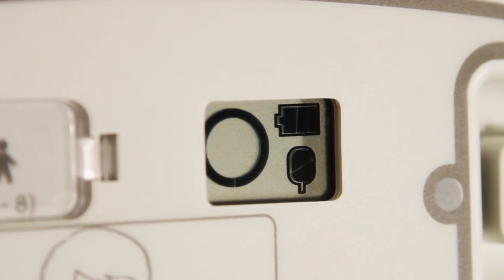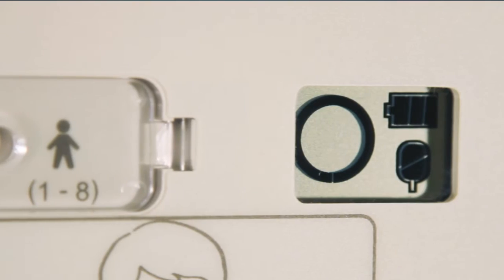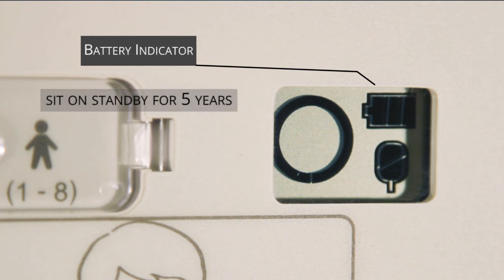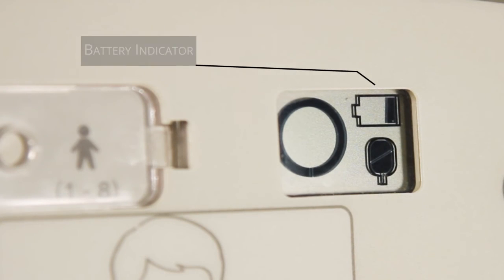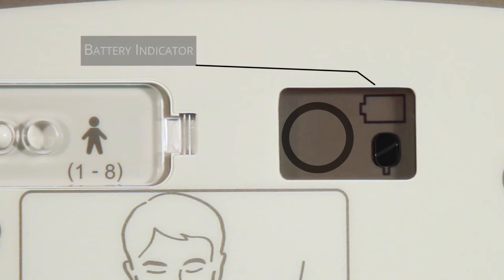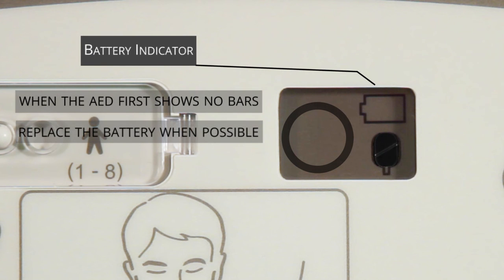Secondly, the battery status indicator will inform you of how much battery power remains in the non-rechargeable battery. When installed, the battery has enough power to sit on standby for five years. When the battery indicator is at one bar, a new battery should be ordered. When the battery indicator changes from one bar to no bars, the battery should be replaced at the earliest opportunity.